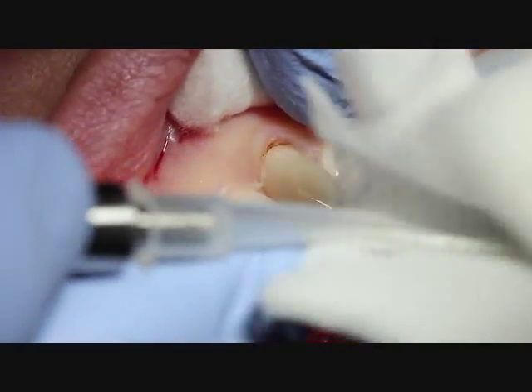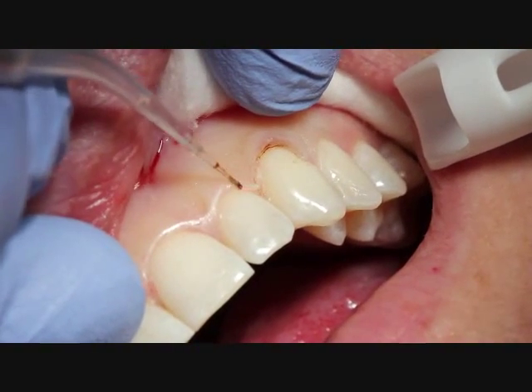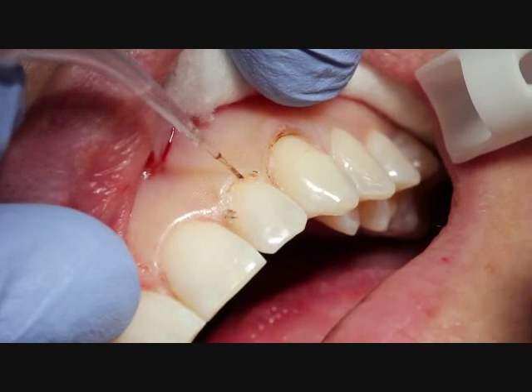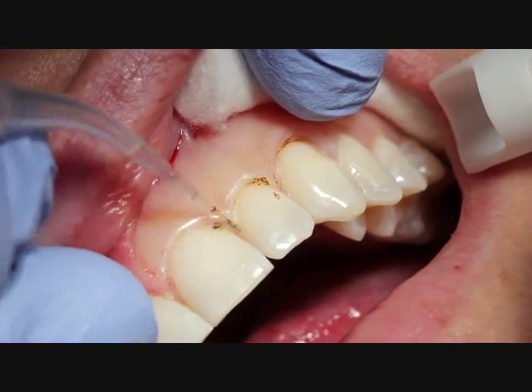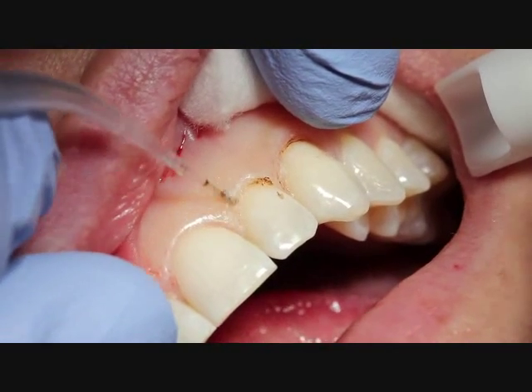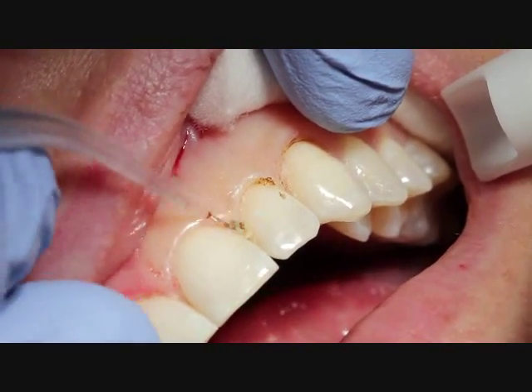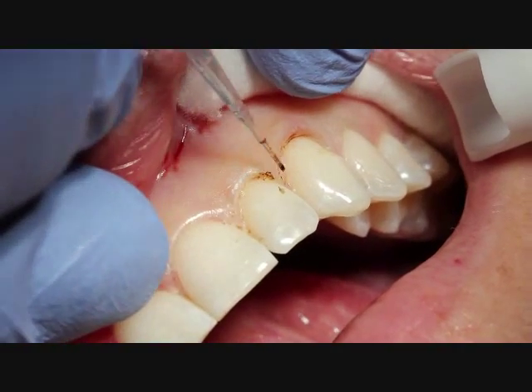Starting with the canine there, the setting for this is 1-watt continuous. Just dragging it along in a little paintbrush motion, taking a little tissue away. We are getting just a little slight charring, which we'll be taking care of at the end — we'll just use a microbrush to gently take that away. It's very superficial and it's not going to cause any recession or any post-op problems for the patient.